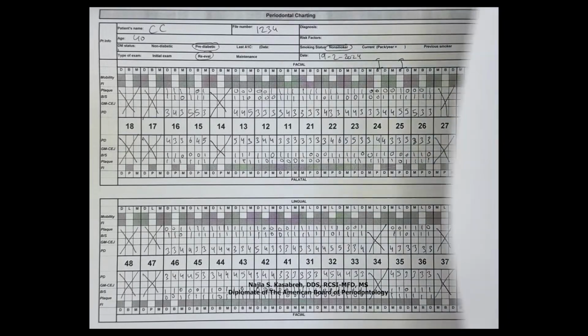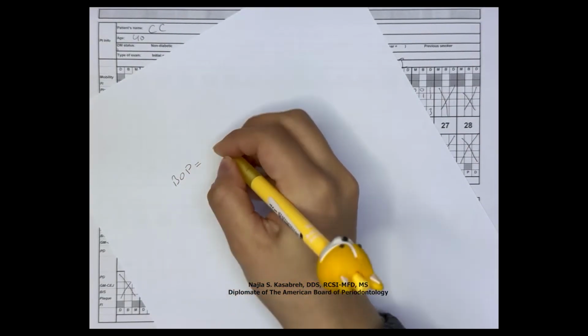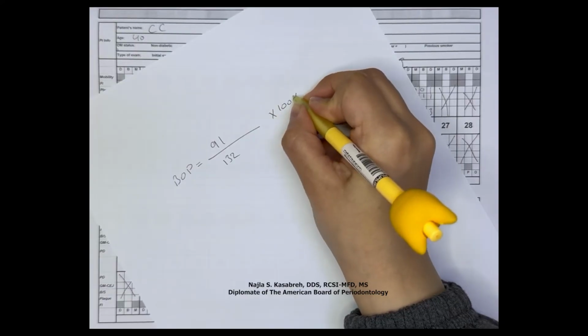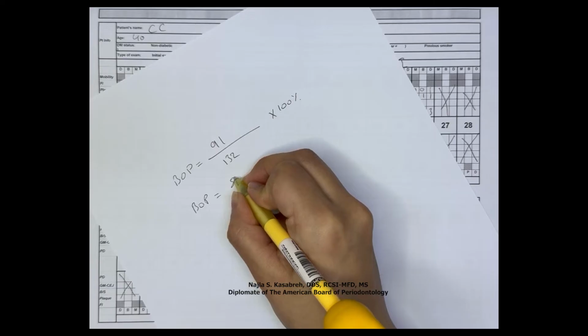If we look at the chart again and count the bleeding sites, the numerator will be 91. 91 will be divided by 132 and multiplied by 100%. The percentage of bleeding on probing is 68.9%.